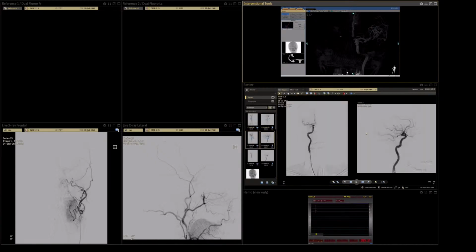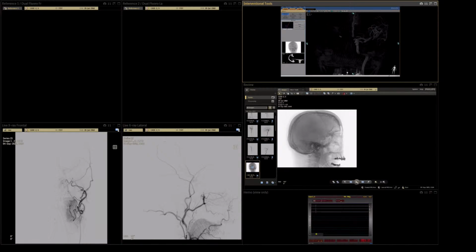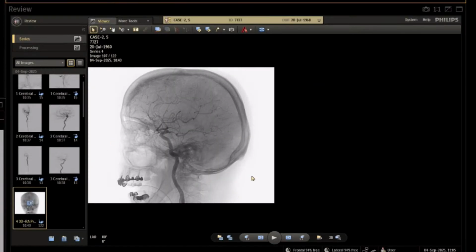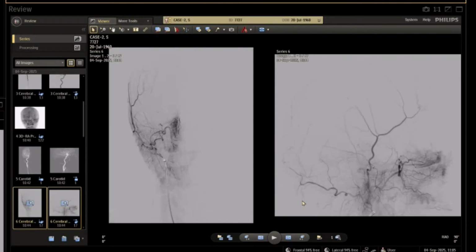This is a presidential hospital, a national hospital in Almaty. Almaty is the previous capital of Kazakhstan. And now we have a patient. The patient is a 65-year-old lady, right? Yes, a young lady, 65 years old. And Rawan Maratlı made an angiography.